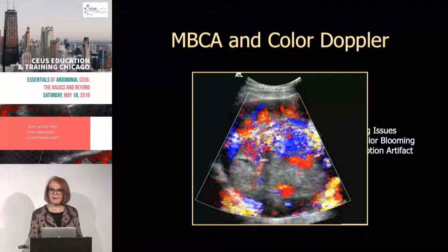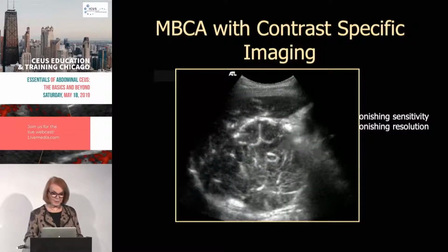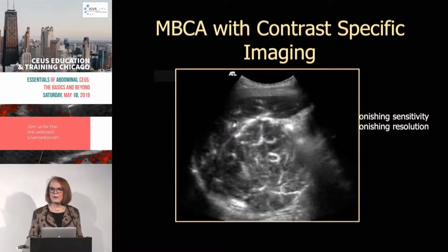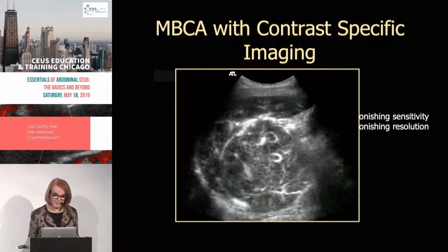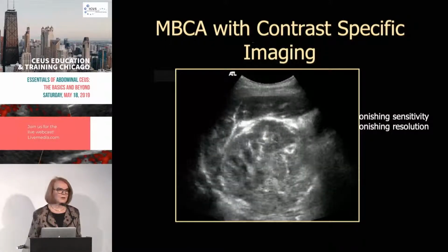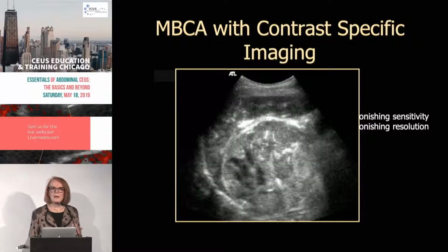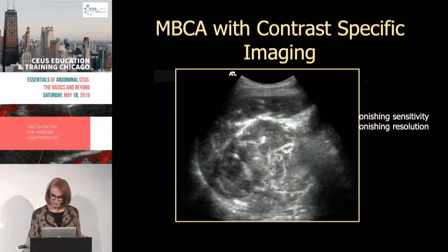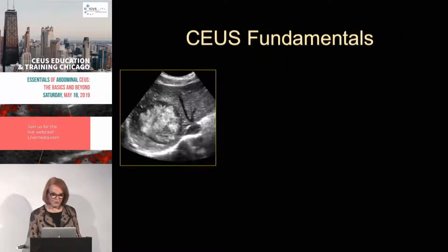Then, of course, we only had harmonic imaging on the machine. As soon as we flicked on the harmonic imaging button, you can see immediately that, even though this is a scan that was done in about the year 2000 probably, an old scan, there I was standing only moments later looking at those beautiful vessels, and you can see those hairpin turns in the corkscrew vessels, and you could appreciate immediately what great capability was coming to us with contrast ultrasound. And that resolution is something that's still just an absolutely inspiring part of what we do.